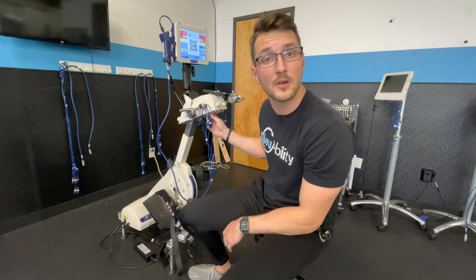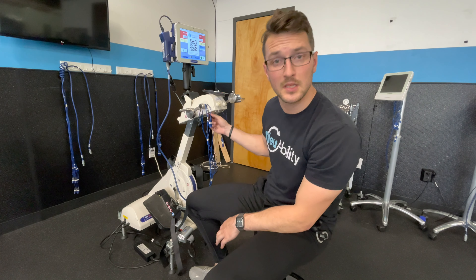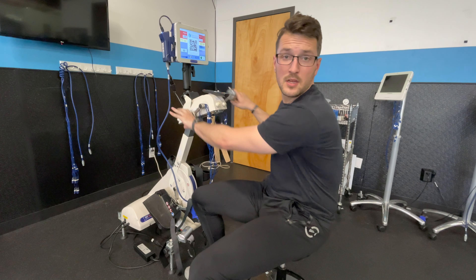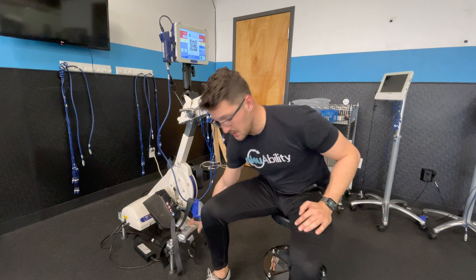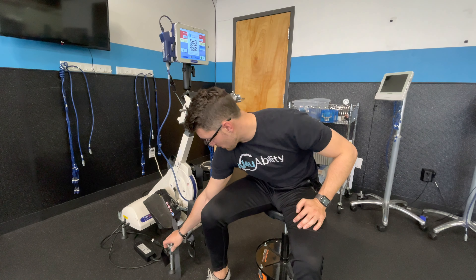This machine is slightly different from our others as it also allows an arm bike function. This black knob here acts as a lock — I can pull and unlock it, and this becomes an arm bike. For the arm bike we place electrodes on deltoids and forearm extensors. It also has adjustable height via these locks, and a wheel so you can move it around into position.